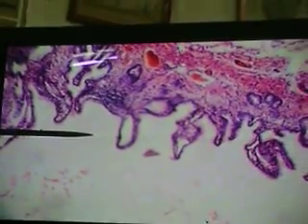Basically, the way we differentiate them is analogous to the situation when we do the urogenital system. We're going to see urinary bladder and ureter. How do we differentiate urinary bladder and ureter? How do we differentiate gallbladder and bile duct? In the bile duct and in the ureter, generally speaking, you can visualize a good amount of the lumen.